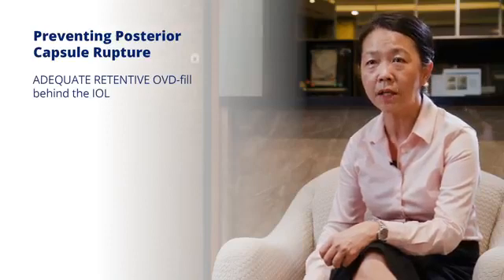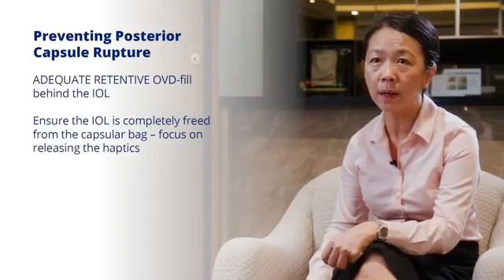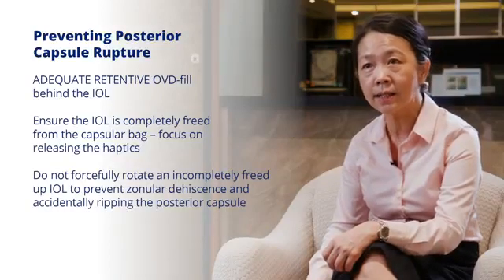So when we do a rotation of the lens like this, the most fearful thing is really to have a posterior capsule rupture that we cannot handle. So it's important to have adequate retentive viscoelastic, and you want to always fill this up behind the lens so that the lens can rotate freely. It's important to ensure that the lens is completely freed from the capsular bag, and you want to focus really on releasing the haptics.